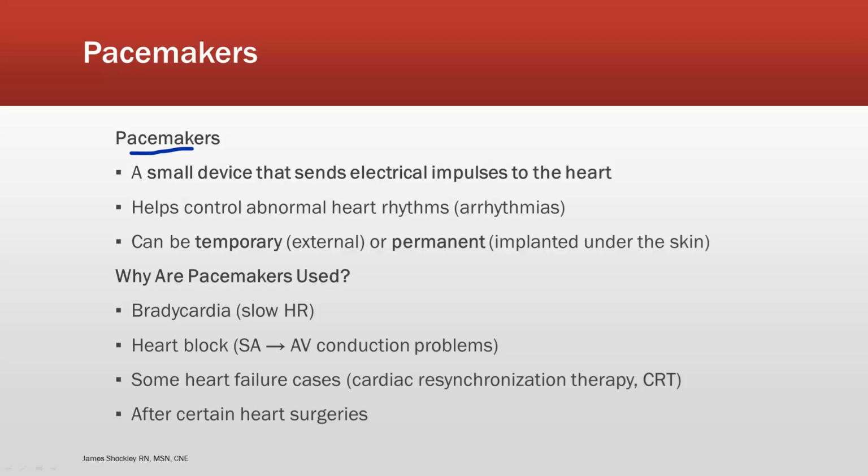It's a metal device that we're going to implant into your person, and we're going to connect wires on the inside of your heart to your atria or to your ventricles or to both. We do this because maybe you no longer have an SA node that can maintain cardiac output. You have a long history of bradyarrhythmias, and we want to fix that issue. We've talked about temporary, where we're pacing them externally using the pads, or obviously if they're going to go out for surgery.